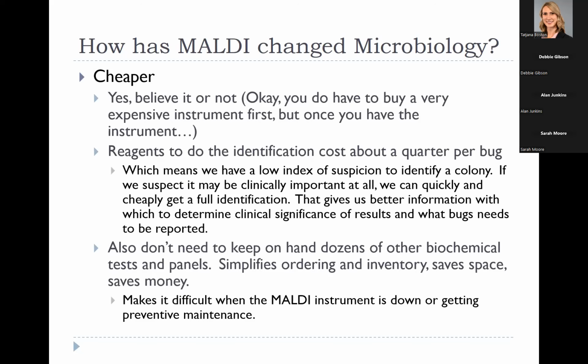So you look at those and say, those are basically contaminants until proven otherwise, especially Corynebacterium and Bacillus. So if this were called a Corynebacterium in a laboratory that did not use MALDI, you'd say that's a normal skin flora bug, that's contamination.